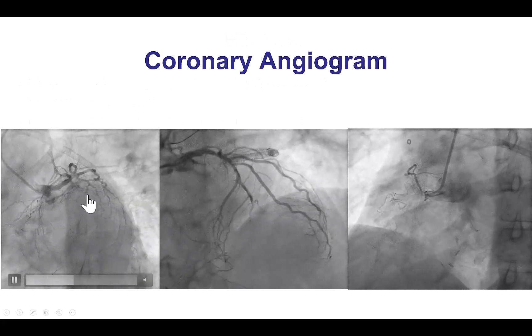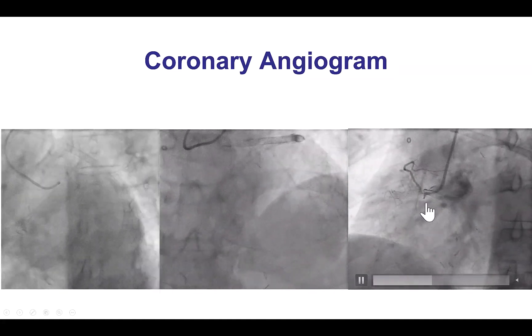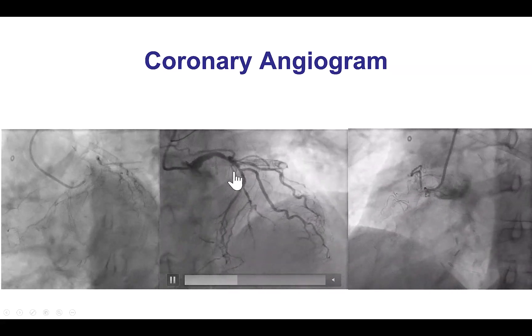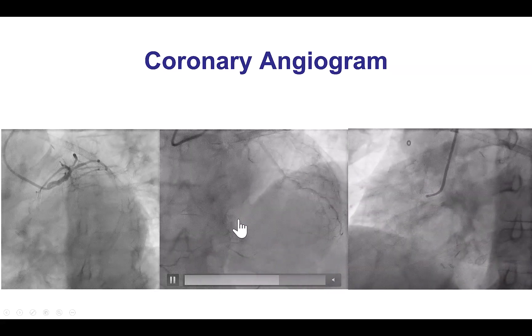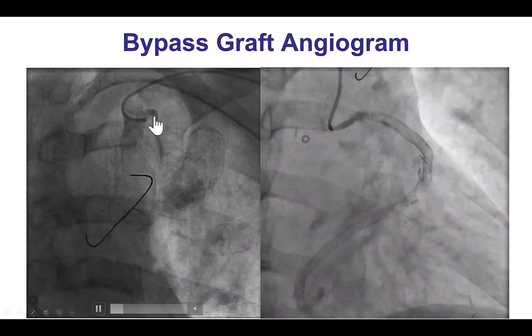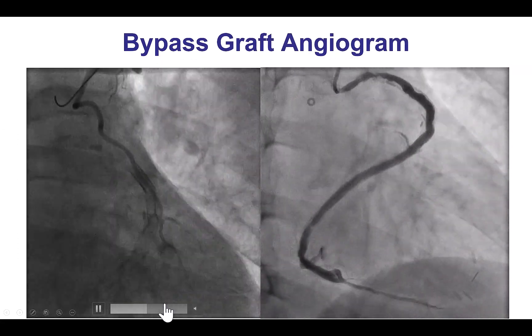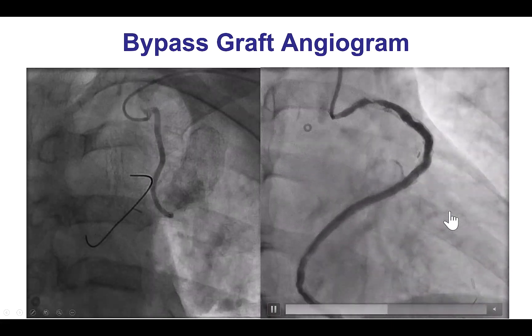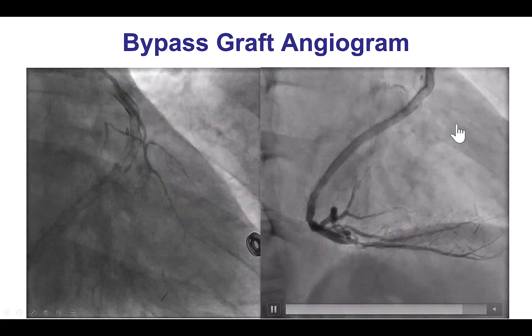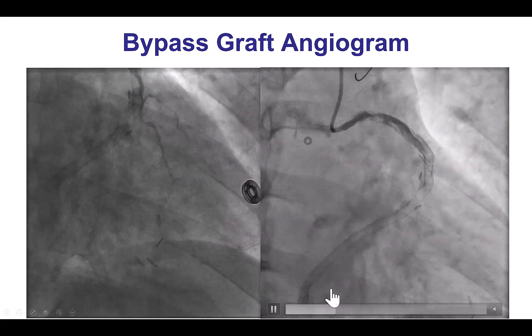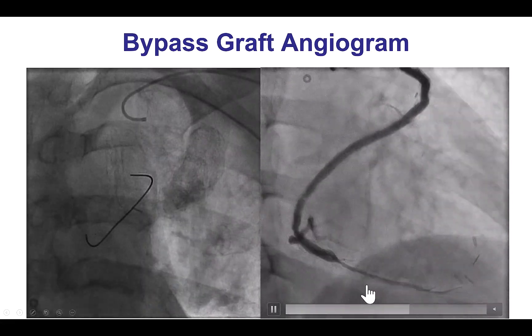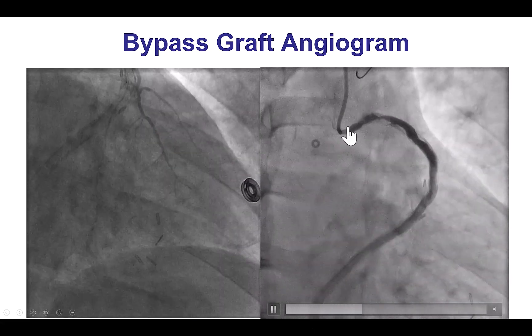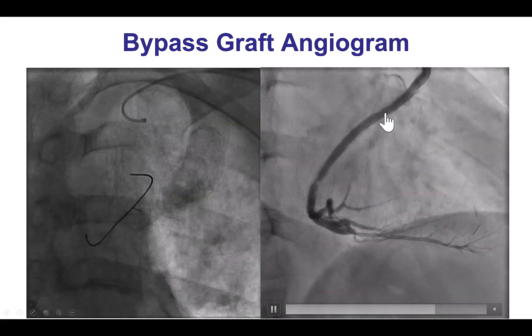This is his angiogram showing an ostial circumflex CTO and ostial RCA CTO. There is disease in the LAD with competitive flow from the LIMA, and here is the patent LIMA graft, as well as the sequential saphenous vein graft. The first obtuse marginal is a very small, diffusely diseased vessel, but the PDA and the posterolateral are very large. This vein graft has a significant in-stent restenotic lesion in the proximal segment.